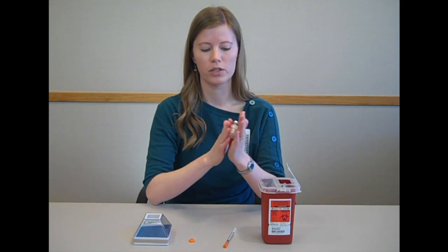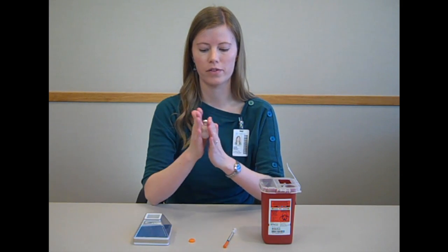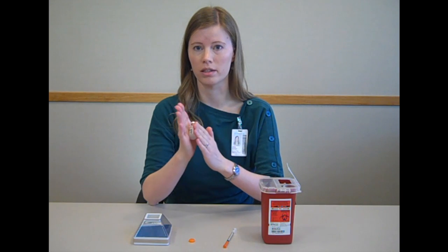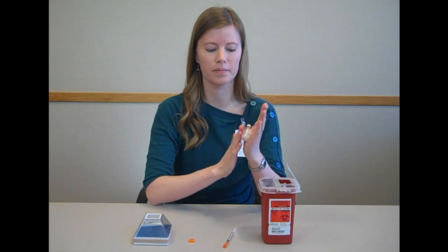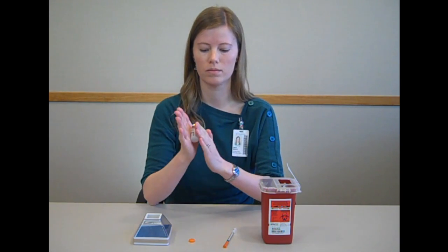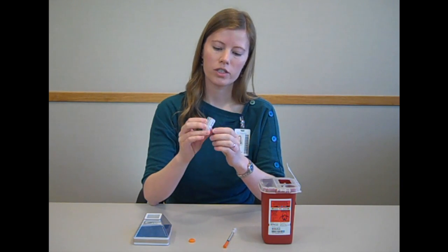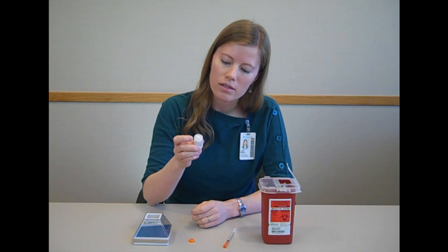Then roll the insulin between your hands for 15 to 30 seconds. You never want to shake insulin — you always want to roll it to mix it. After you're done, check to make sure that there's nothing settled at the bottom.